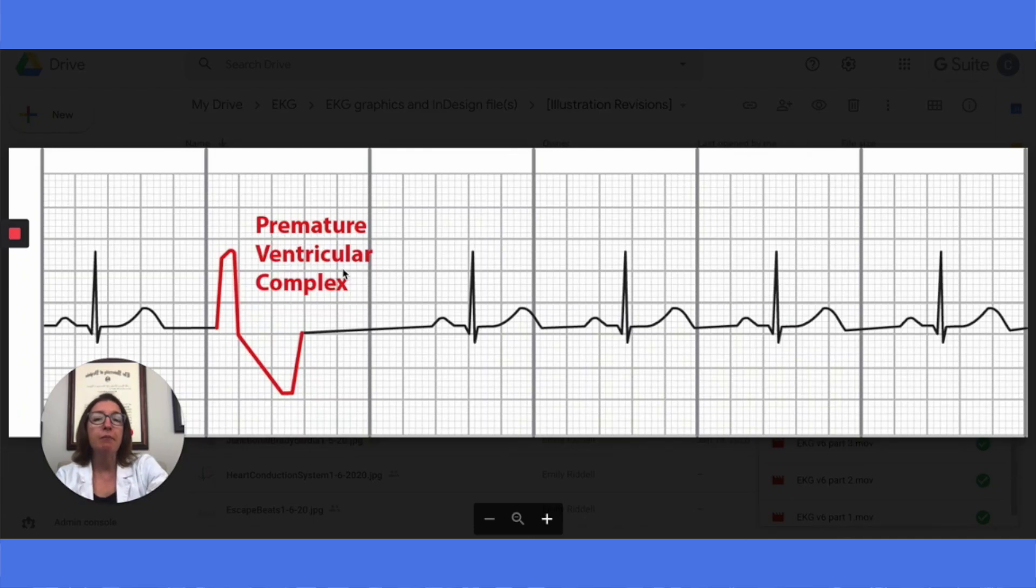A PVC is an abnormal impulse that originates from the ventricle and occurs early. With the PVC, the premature complex will not have a P wave, and the QRS complex will be very wide. So it is definitely over three small boxes wide.